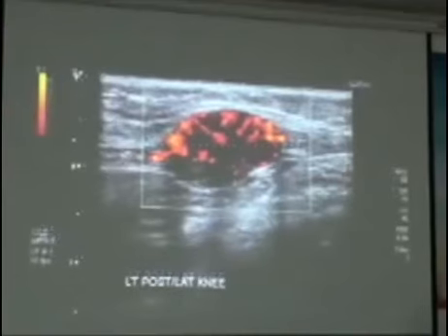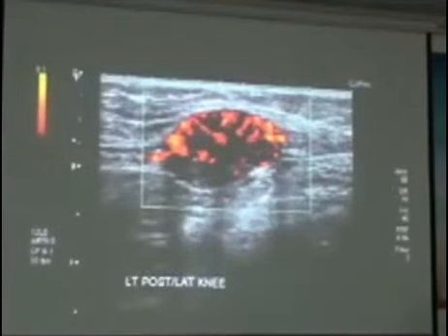And you can see that there's normal nerve fibers there, and then it comes up, expands, and then there's normal nerve fibers more distantly. Trước cái khối này là dây thần kinh bình thường, sau khối này là hình ảnh dây thần kinh bình thường.